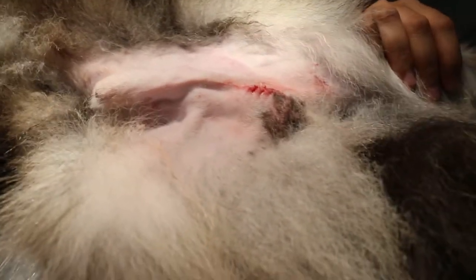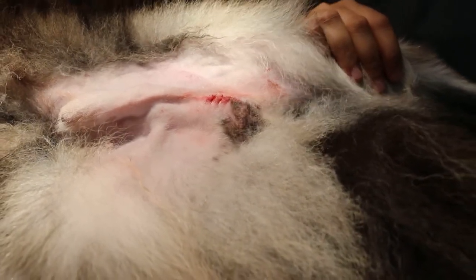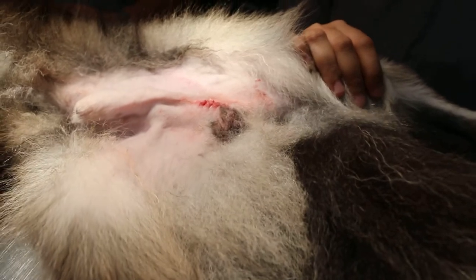For this Shetland, I used injectable anesthetic domitor plus ketamine at 0.2 plus 0.25 ml IV in one syringe.